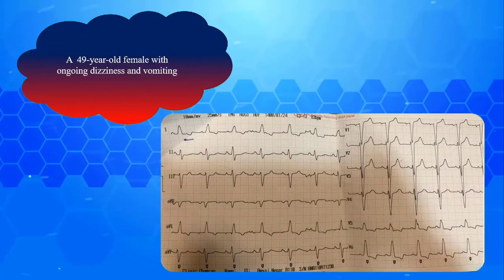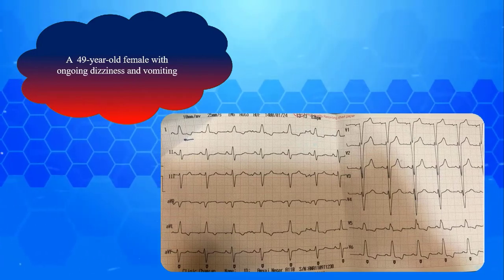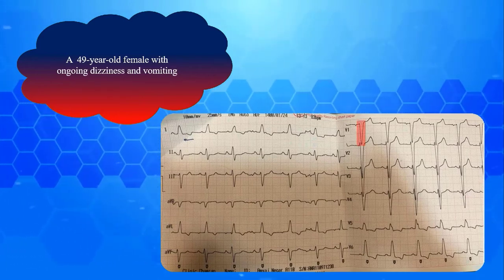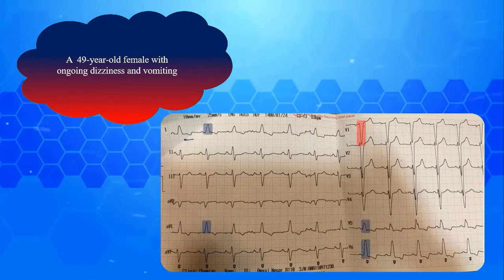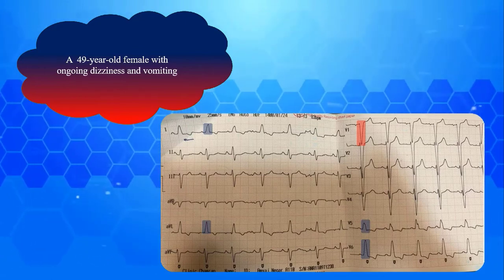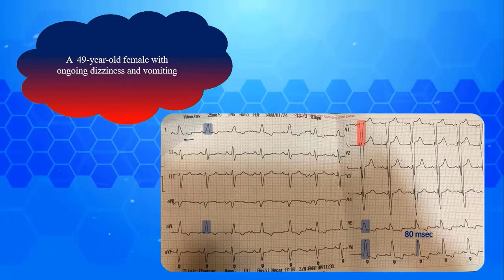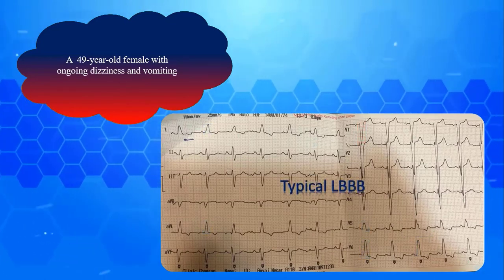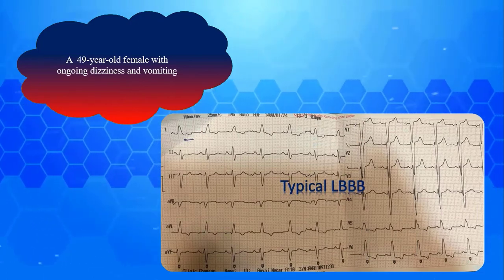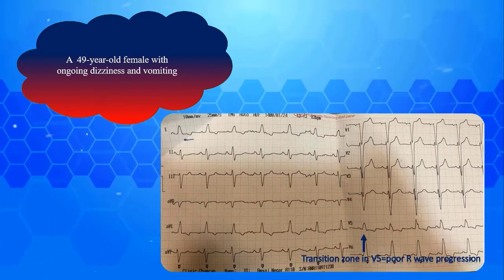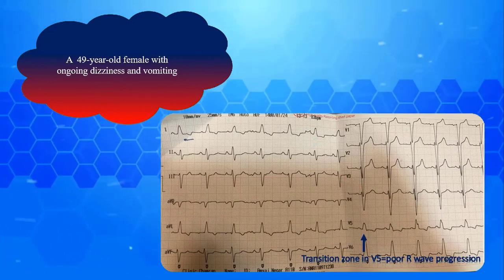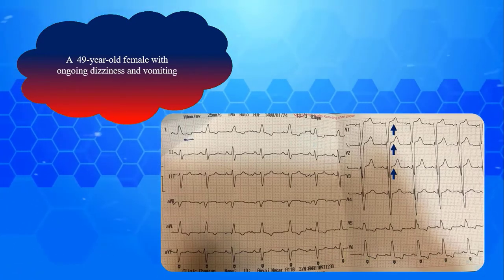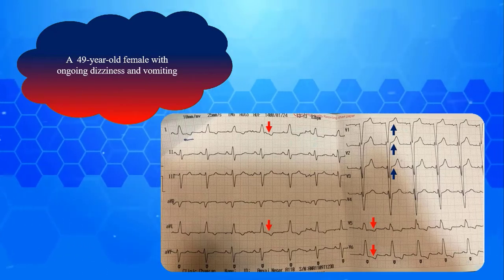The next EKG is obtained from a 49-year-old female with ongoing dizziness and vomiting. Again the QRS complexes are broad with deep S wave in V1 and notched R wave laterally. No septal Q wave is observed in lateral leads. R peak time in lateral leads is obviously prolonged at about 80 milliseconds. Therefore this is a typical LBBB as well. Other associated findings are delayed R wave progression and occasional discordant STT wave changes — ST elevations with upright T waves when deep S wave is present, and ST depression or inverted T wave where slurred R wave is recorded.